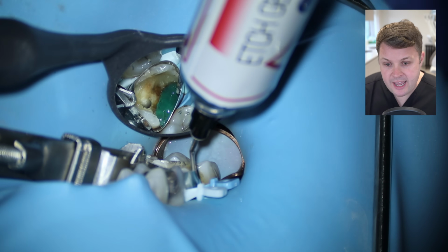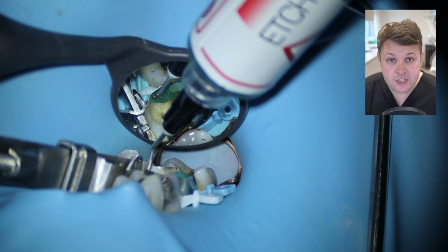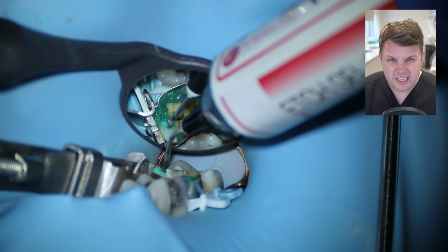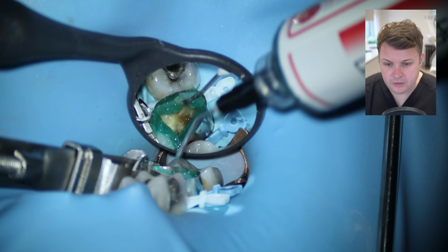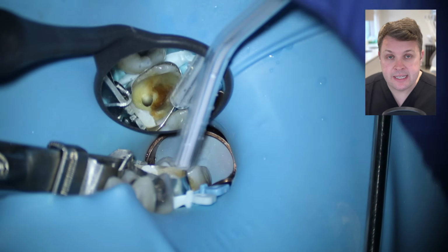I am just etching the enamel for now. And then what I do like to do is, once I feel like I've etched the enamel, I do place the etch just on the dentin, just momentarily, not too long. And we can see here now that the cavity is ready to bond. I'm using iBond in this case.